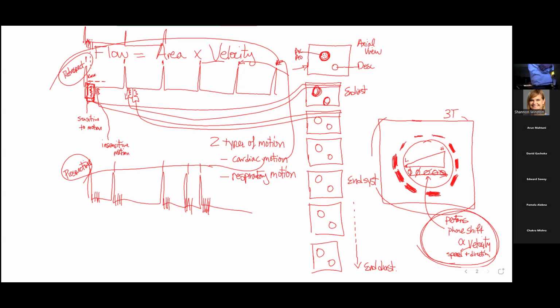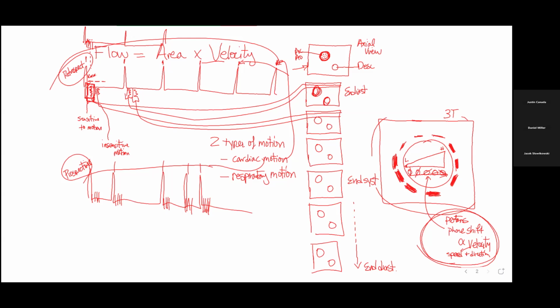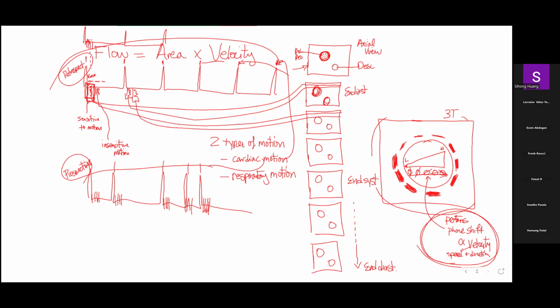Respiratory motion. Now, last week, when we were measuring LV volumes and EF and getting these beautiful cine movies and all that kind of stuff, we held our breath, right? We held our breath for periods of about 7 seconds. And we did some phase encoding grouping and all that kind of stuff, to group these things together so we could get a whole bunch of lines at one time, and fit everything into about a 7 or 8 second breath hold because we were able to take care of the respiratory motion with breath holding.